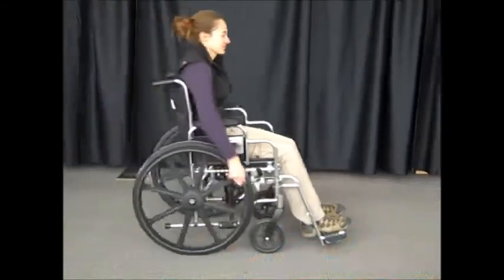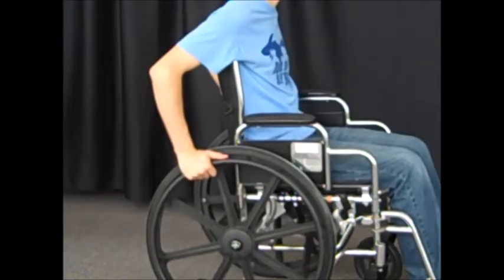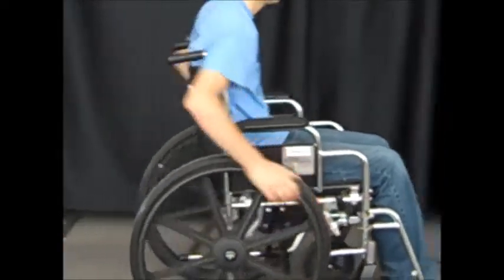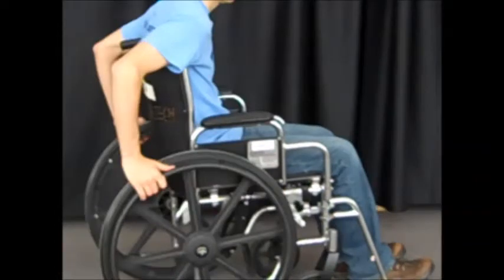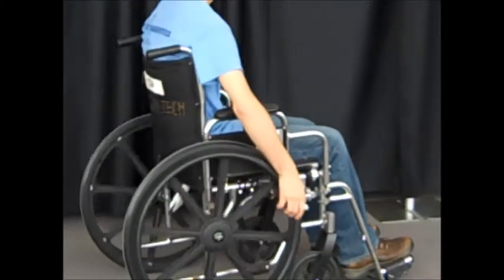The propulsion cycle is composed of the push phase and recovery phase. The push phase can be broken into flexion and extension. First, the user grabs onto the rim behind the axle. The biceps and brachioradialis power the flexion portion of the push phase. Next, the triceps extend and the anterior deltoids flex to complete the push phase.